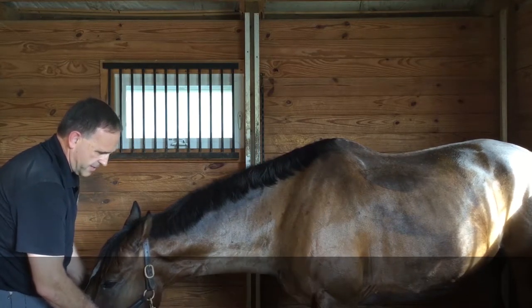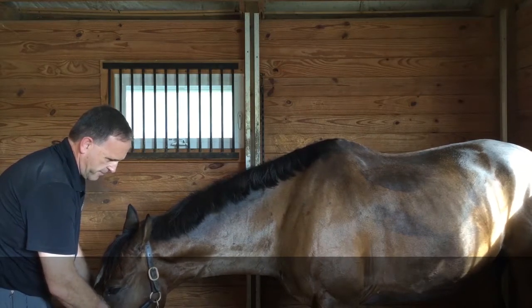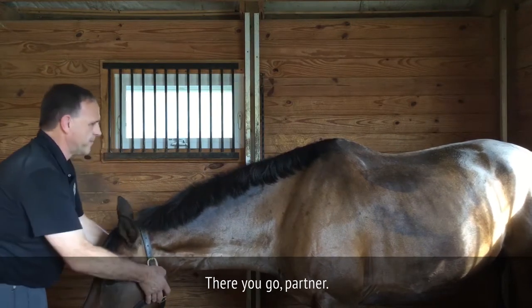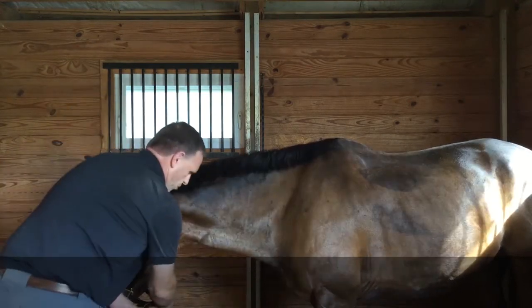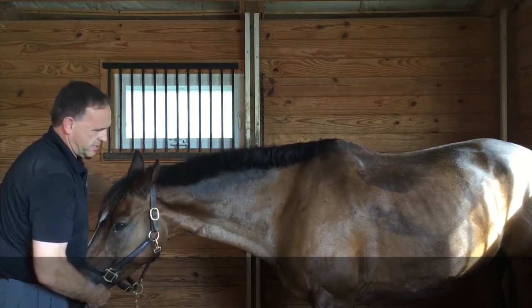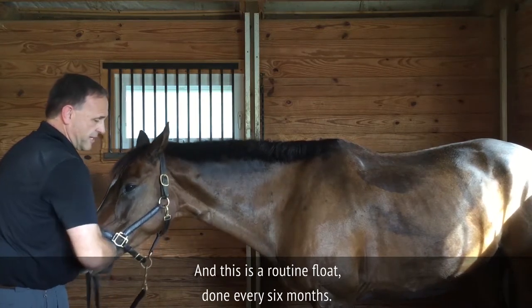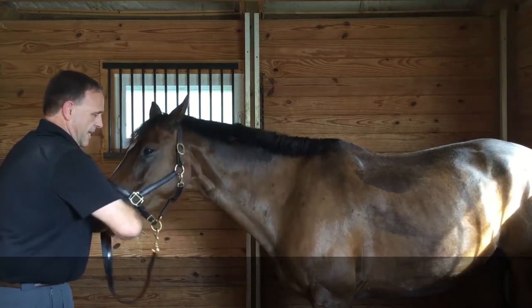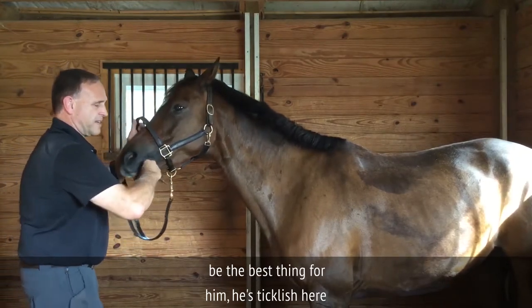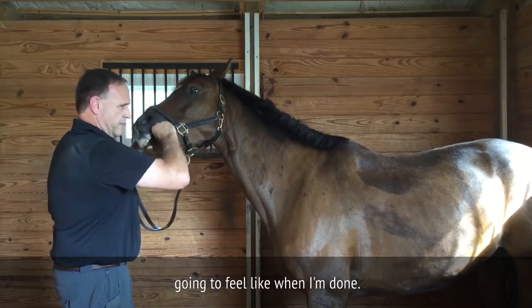The horse absolutely just loves this. The horse looks drugged, but I promise you there are no drugs anywhere near this horse — that's just total relief. This is a routine float done every six months, and he just knows. Even though the process may not be the best thing for him, he's kind of ticklish here and there, but he's well aware of what he's going to feel like when I'm done.